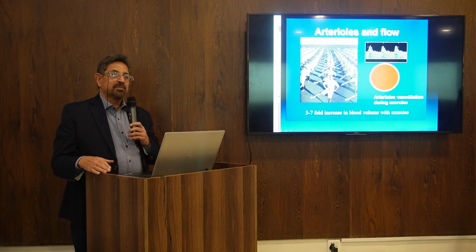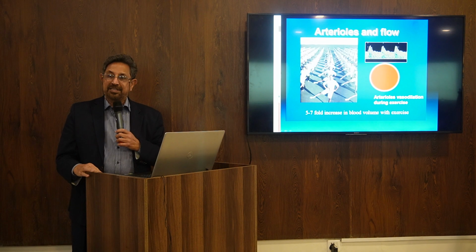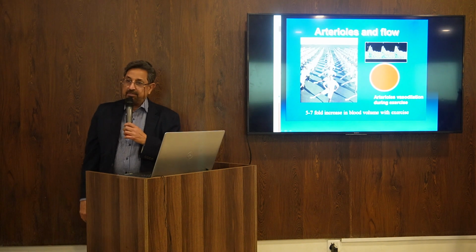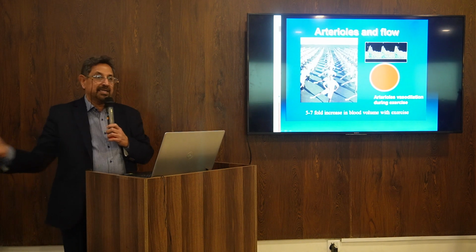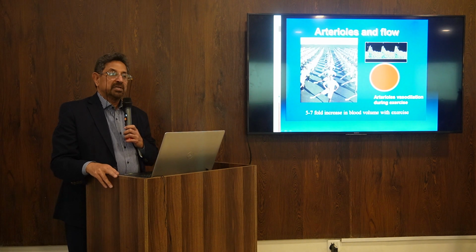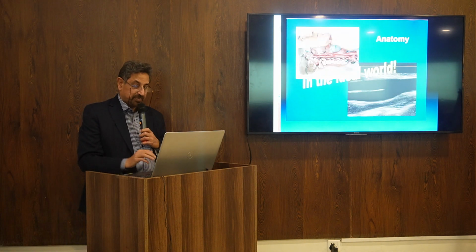Don't scan a patient who has come huffing and puffing from the street in a rickshaw and rushing to you. "Doctor, my time, I'm very busy, I can't wait for you." "Lie on the bed and put your..." No. You have to give time to the patient, otherwise you will get erroneous information.